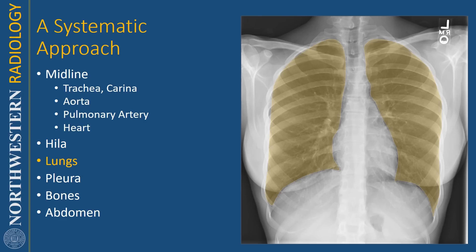Then I look at the lungs in two different ways. First, I zoom in on the right lung and look at that lung individually, looking for nodules, masses, pneumonia, reticulation, and fibrosis. I try to make sure to cover the blind spots, which are the lung apices, the hila, and behind the diaphragm — there's lung that extends behind the diaphragm, and you can see the vessels going behind it.